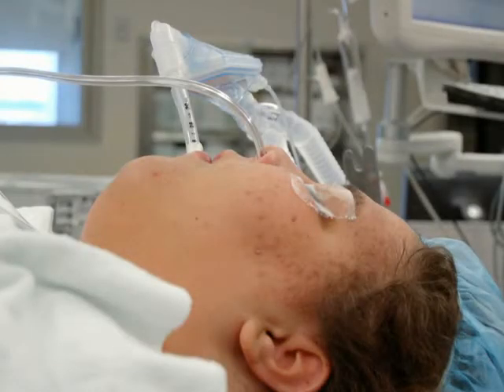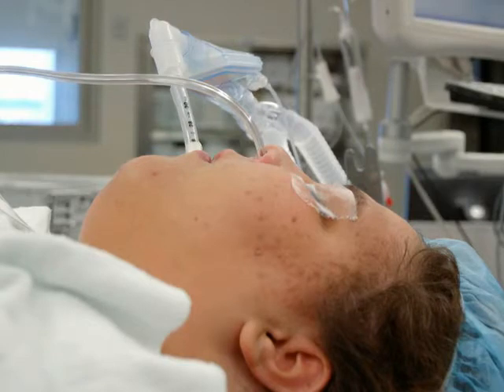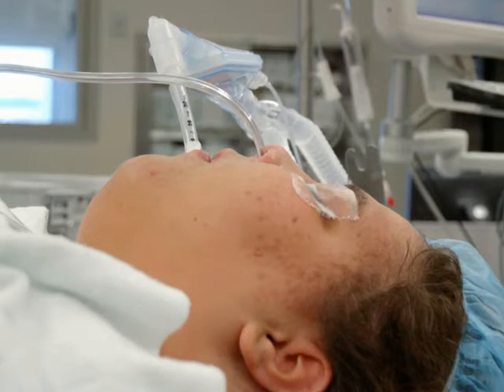A nasogastric or NG tube is placed in a variety of medical circumstances in awake patients, as well as in patients undergoing general anesthesia. Here we demonstrate one method of tube insertion in an anesthetized patient.